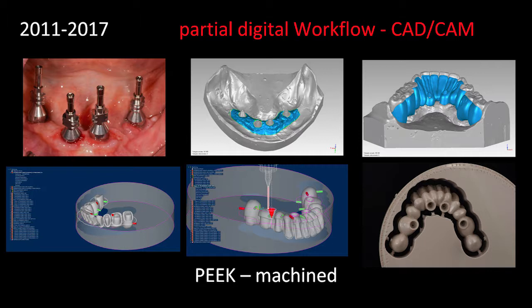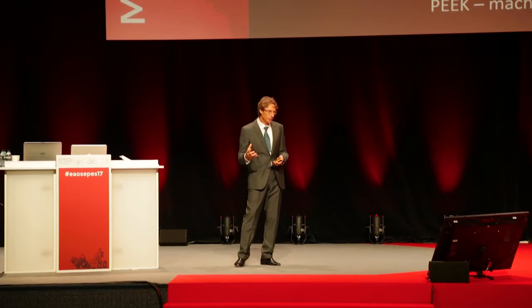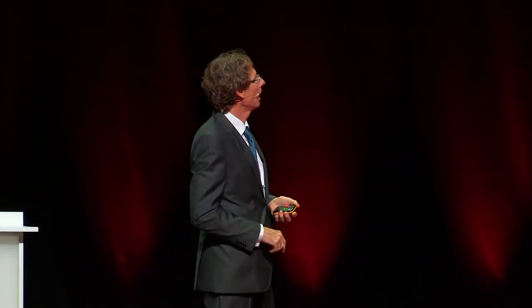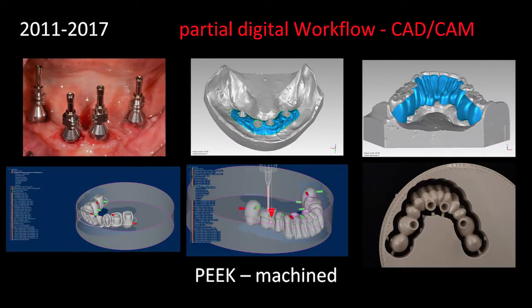We don't use the intraoral scanner, but then we make our plaster model, we make our removable gingiva. Here you see it in blue. We make our design of the framework, and you will see that our designs from the beginning really are quite different to the approach of the Malot clinic. And here you see this milled PEEK bridge in the disc. We have nearly a shiny surface that's coming out of the machine without polishing. You can polish it inside the disc.